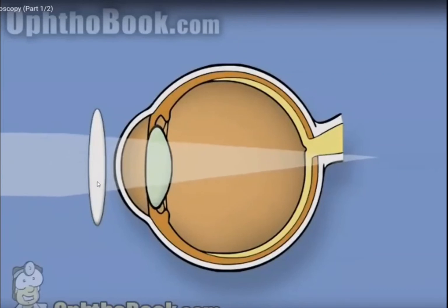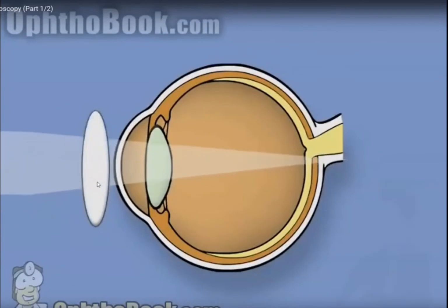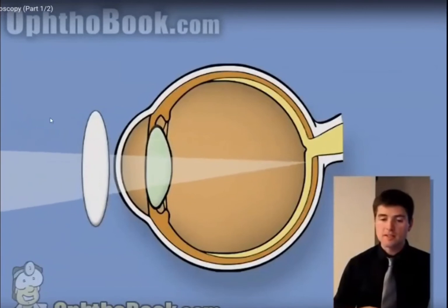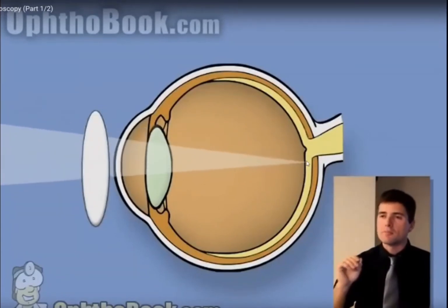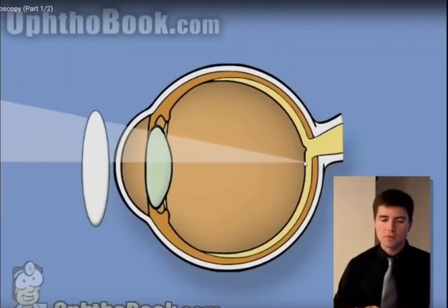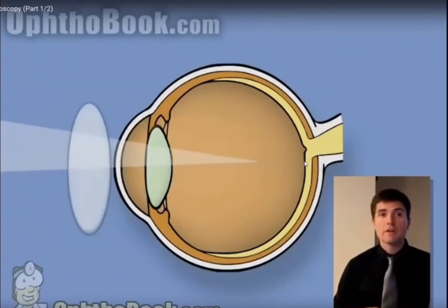So if it's a with movement, that's actually hyperopia. Now, as you improve the refraction and you achieve emmetropia, that light is not shifting anymore. And so if the reflection is static, then it's emmetropic.